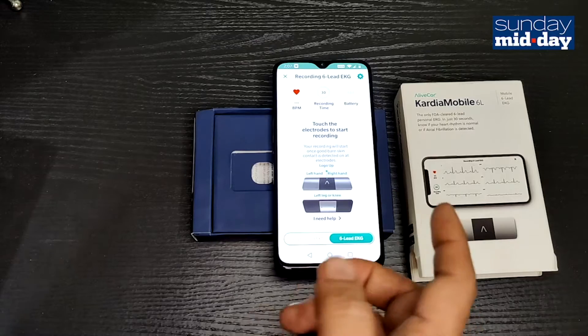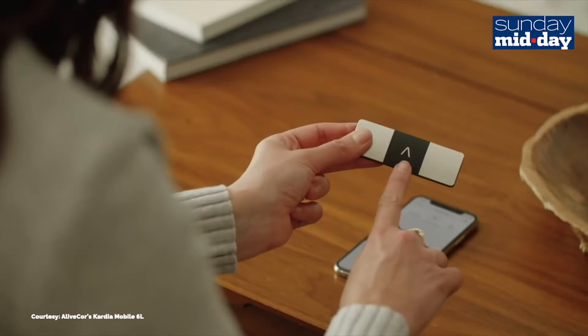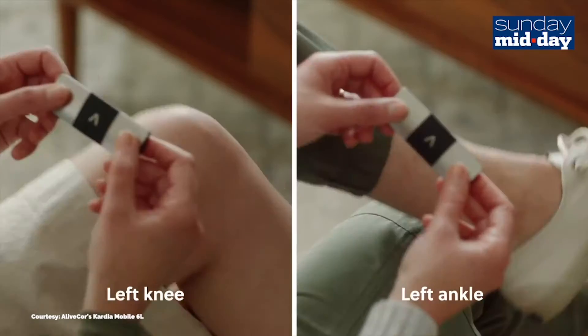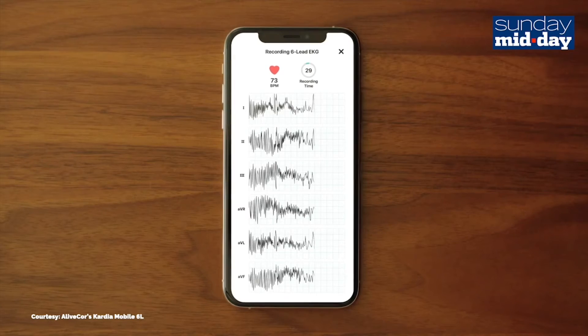For the 6-lead version, you go through the same process — just select 6L instead of single. You place your fingers on the device and then touch the back of the device to your knee or ankle. This entire process takes about 30 seconds.